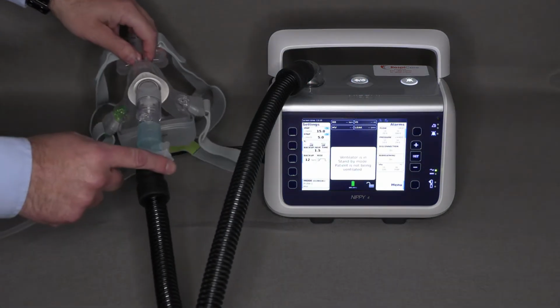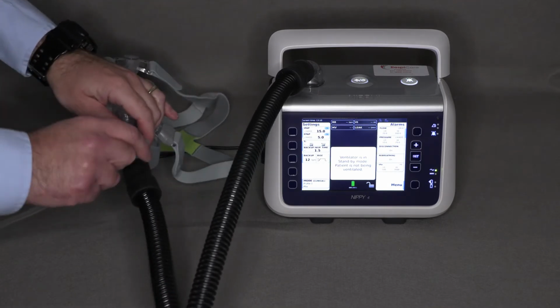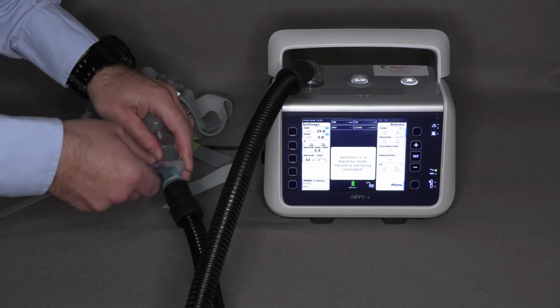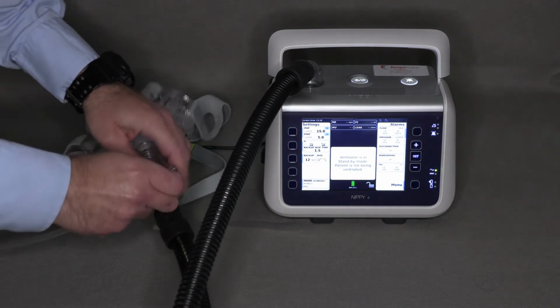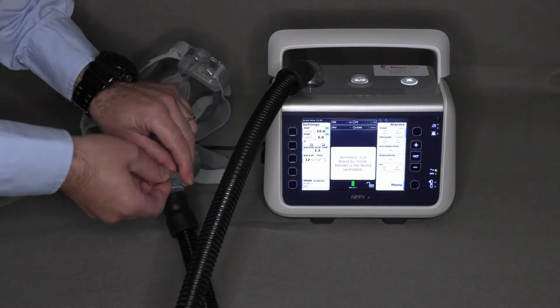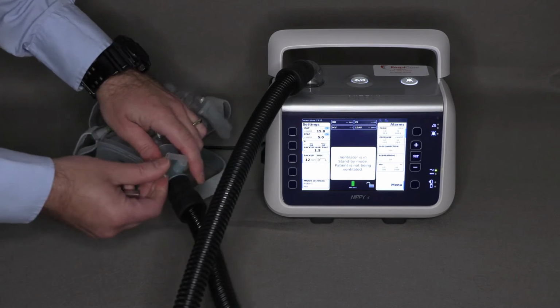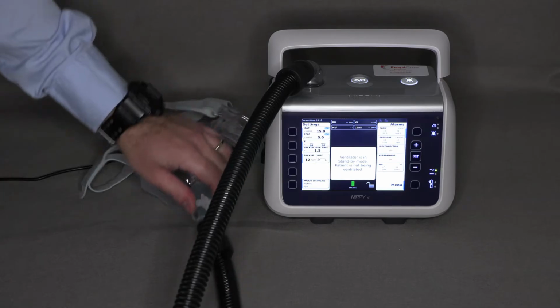To do this, press and release the power button at the top. If you require oxygen to be attached, ensure that an oxygen fitting is between the mask and the breathing tube and an oxygen tube is attached. You'll also need to make sure to turn on your oxygen supply. However, if you don't require oxygen, then you don't need to worry about connecting any.